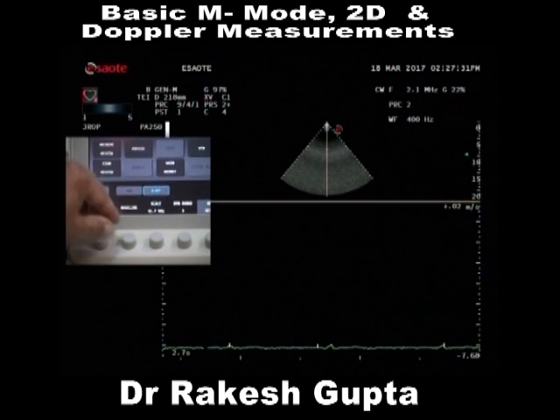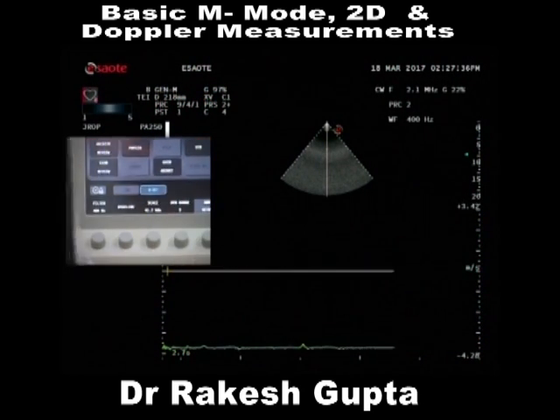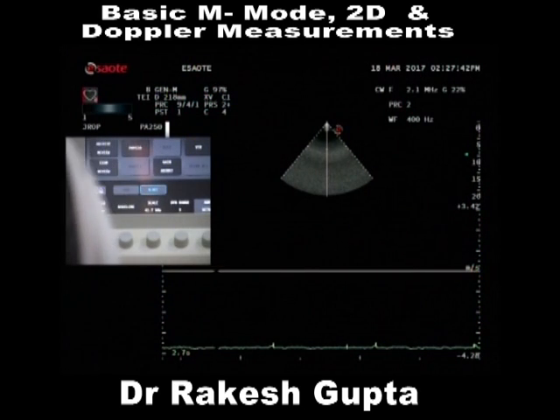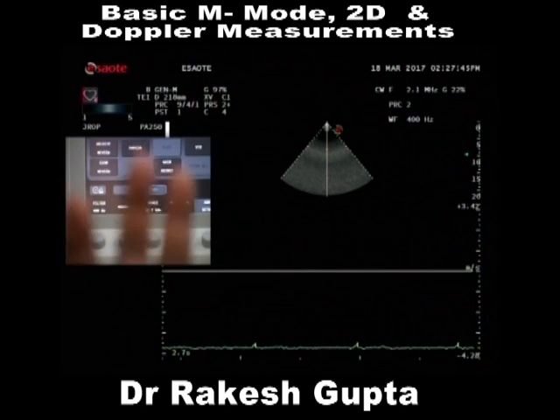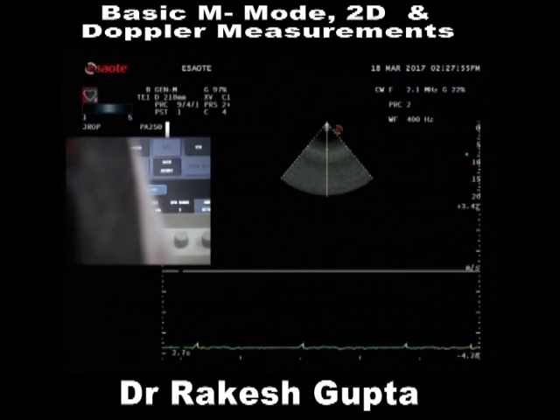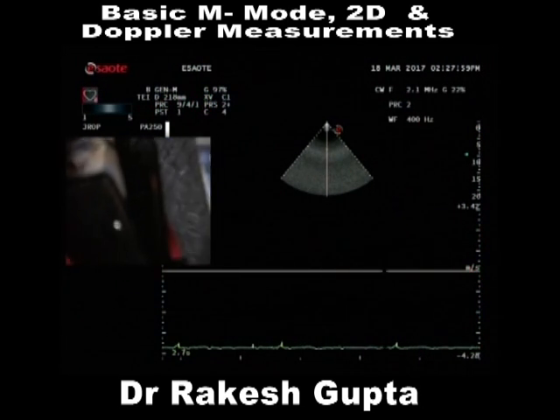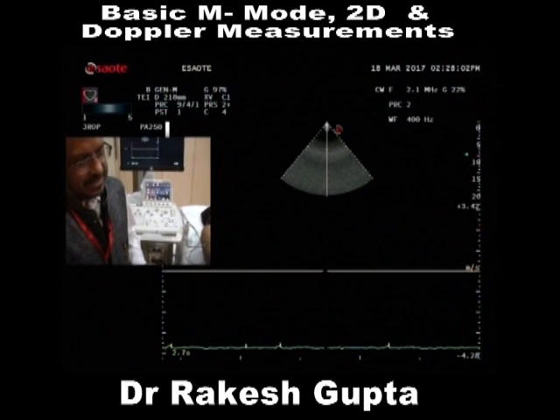What's the utility of all this? Why continuous wave, why pulse wave? Normal velocity for a valve: remember two figures, aortic 1.7, mitral 1.3. Half of aortic is pulmonic, half of mitral is tricuspid. So in normal valves, the velocity required is not high: 1.7, 1.2, maximum 2.5. But when the valve becomes pathological, then you need higher velocities.